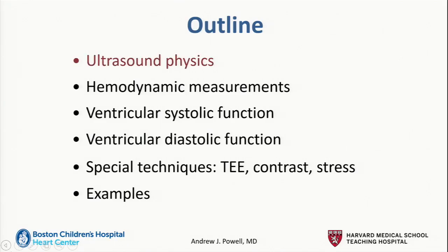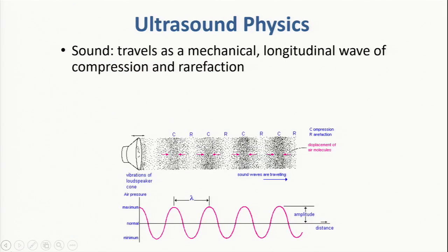All right, with that as our plan, let's begin with ultrasound physics. Like I said, we're covering this because it is specifically mentioned, and I'll try to do it in about 15 or 20 minutes. So let's begin with talking about sound. Sound travels as a mechanical longitudinal wave of compression and rarefaction. Rarefaction means things become less dense. And you can see a diagram of that.